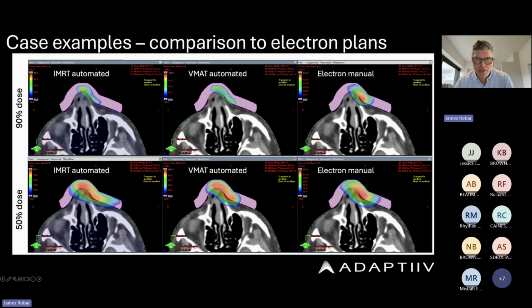Really a couple take-home messages here, and you can probably see it already. The first is much better dose conformity at the PTV normal tissue boundary here, the distal aspect of the PTV. Compared to electron planning here, where unless you're using an advanced tool like a modulated electron bolus, you really have little control over that, and you're picking an energy, of course, out of a coarse set of energies to cover just the deepest aspect of this target volume.